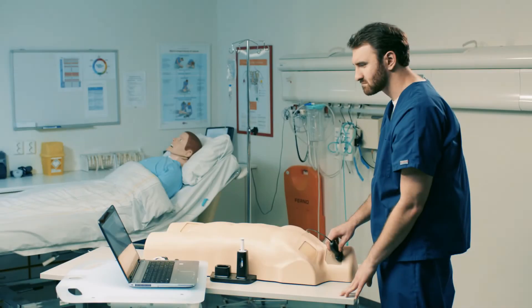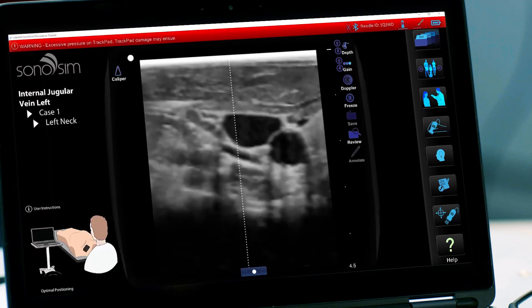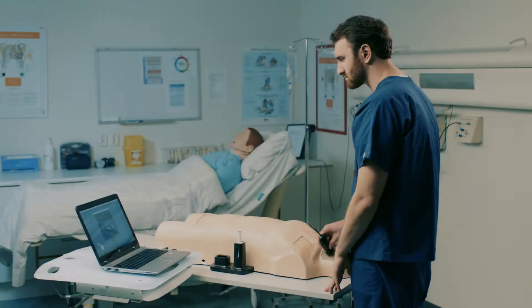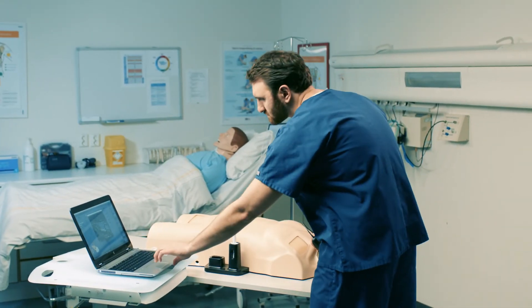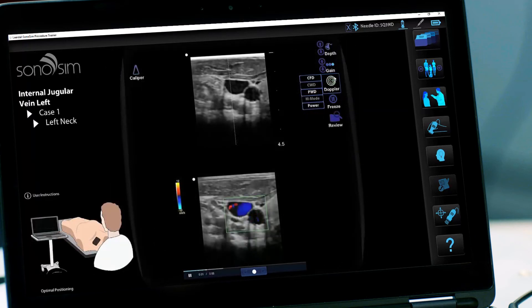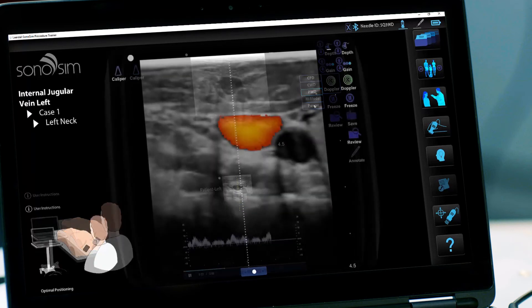To simulate vasculature compression, press on the trackpad with the probe. A message will also display if pressure is excessive. To utilize Doppler modalities, select the Doppler button on the right-hand side of the screen. You can choose from Color Flow Doppler, Pulsed Wave Doppler, and Power Doppler.